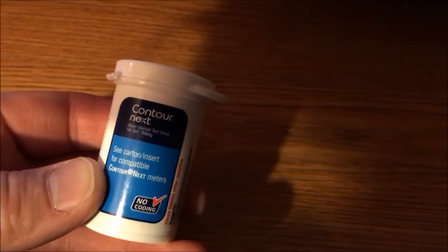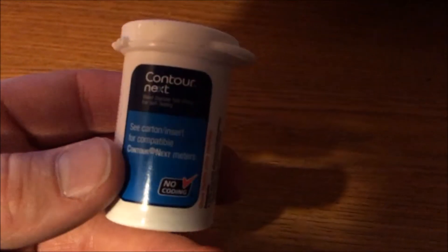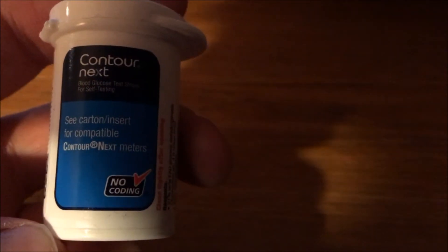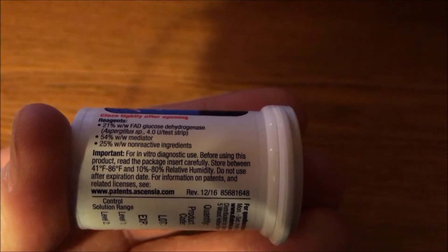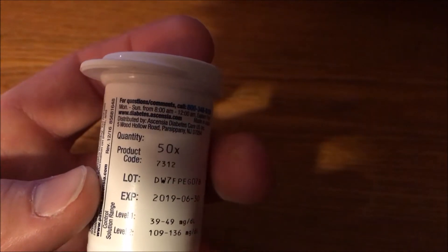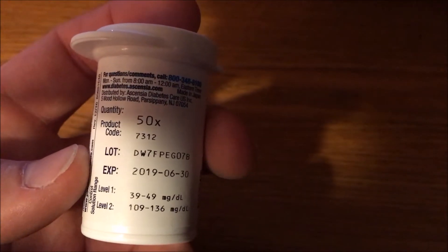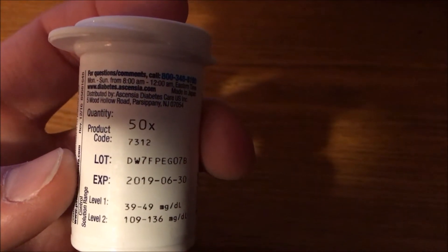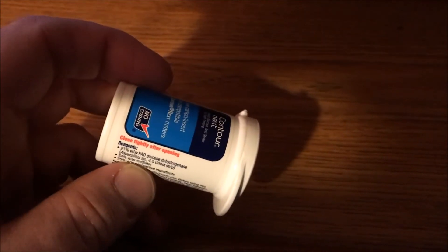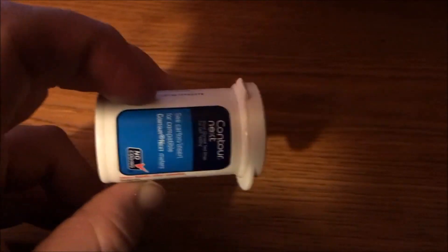In case you haven't seen it yet, this is the new Contour Next bottle since Bayer doesn't have it anymore. You can see there's no Bayer logo there anymore — it's been removed. Somewhere in here it says Ascensia Diabetes Care. So there it is. The updated ones have finally come into circulation.